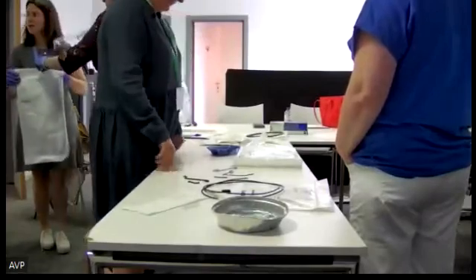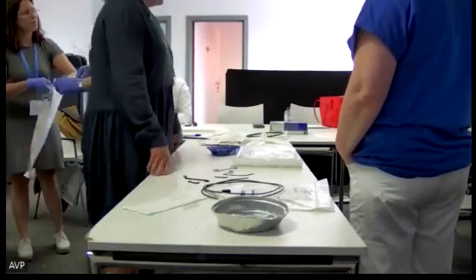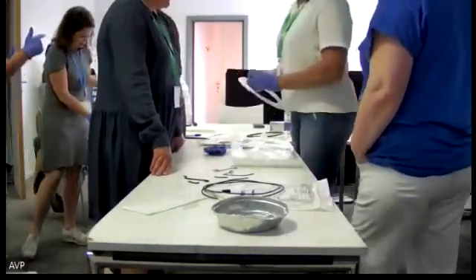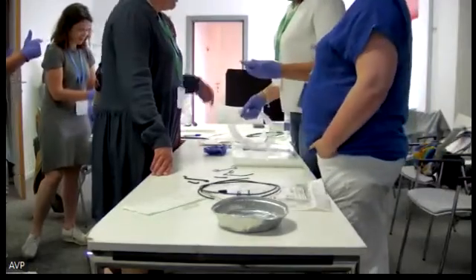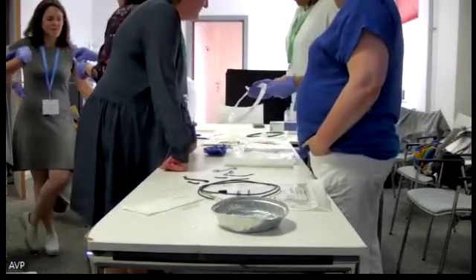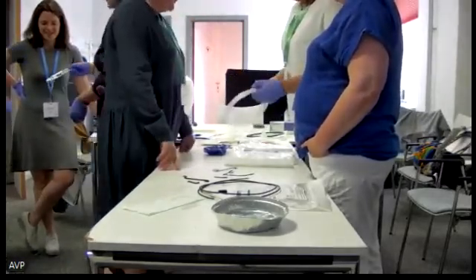How much suction do you use? The vacuum. How much aspiration do we put? We saw it was 20. We only use 5, or 3 of 10. We don't do a lot. We never did it well, actually.